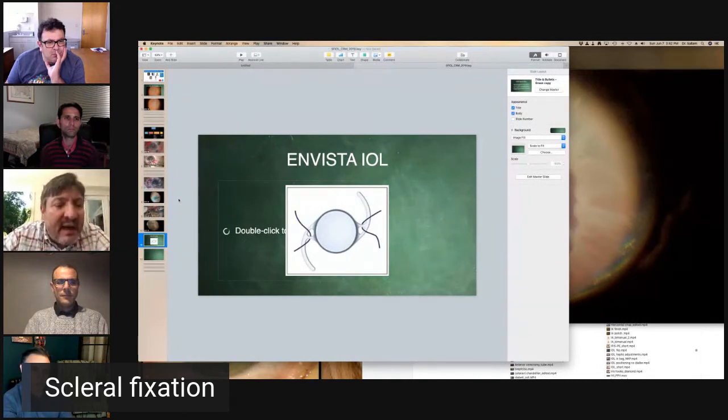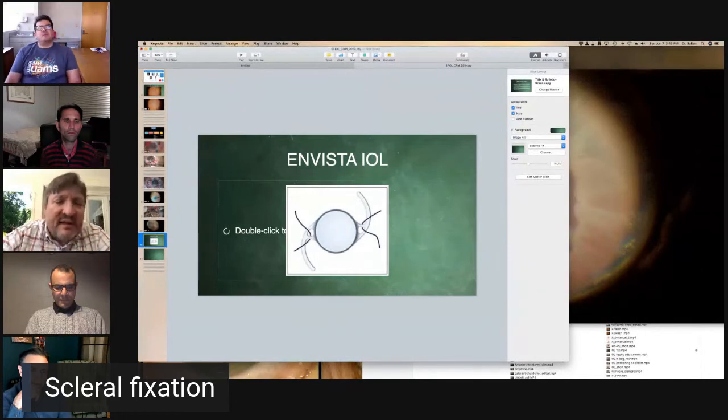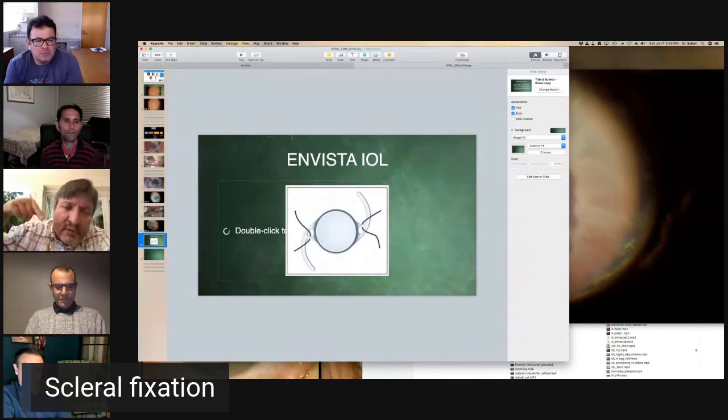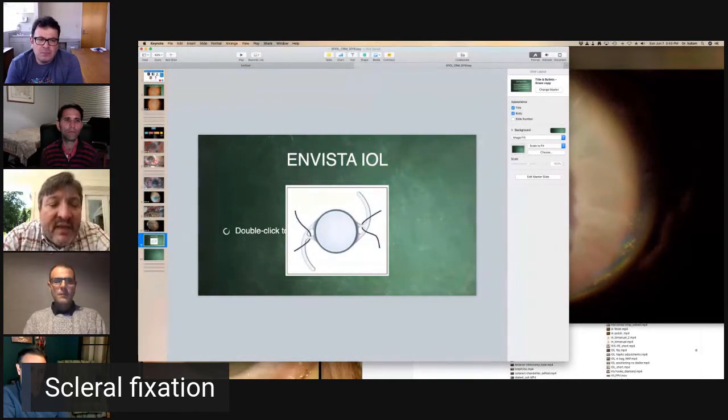Mike Hader and Luke Linzel are colleagues that have done that, and they now use a loop through the eyelet and over the end of the haptic. That's the way I rescue CZ70 lenses that have fallen into the back of the eye. I'll take a little Gore-Tex loop, put it into the eye, twist it together, and feed it through the eyelet, then open the loop, put it over the haptic, and suture refixate. That works here.